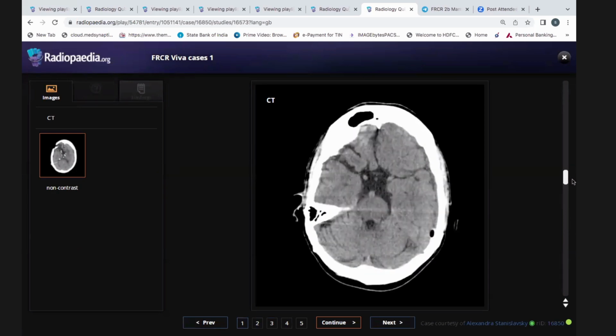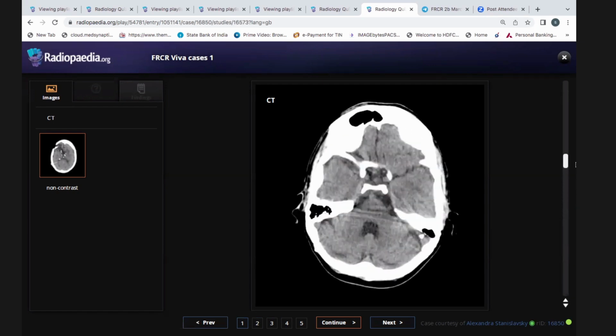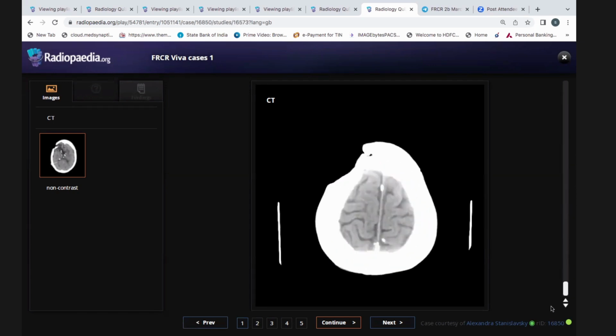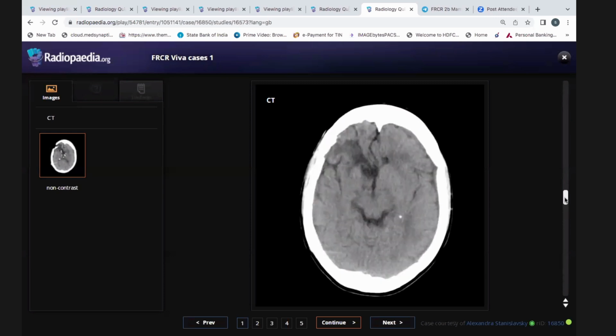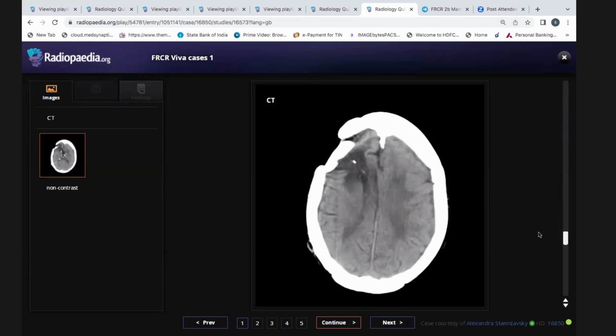This patient had been operated previously and now is being evaluated because of some recent complaints. For the routine follow-up, the patient had come up for that.